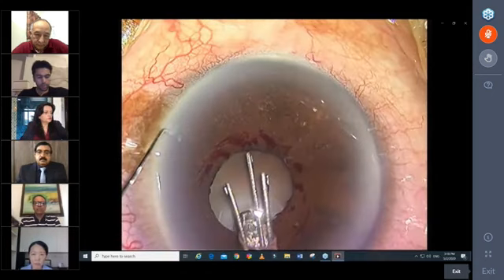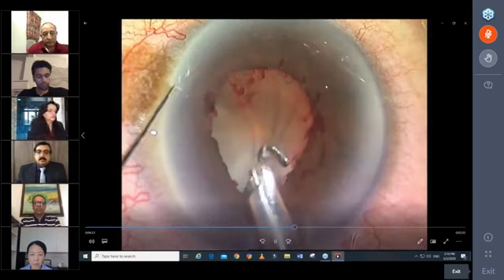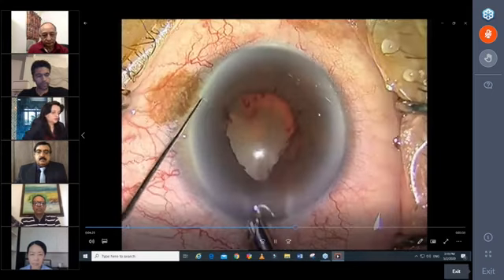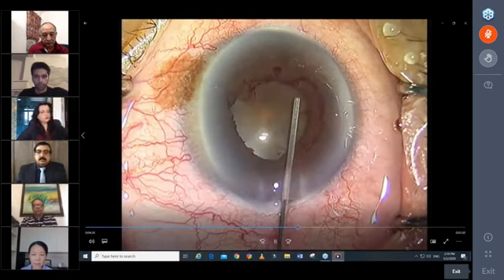So you're putting all these Coughlin hooks on the edge of the pupil. It helps to put just some viscoelastic underneath before you engage the hooks. All right, and it looks strangely triangular, but you will see once you put in the OVD, the pupil actually expands very beautifully and is round and is a good size. All right, and you don't need other devices.